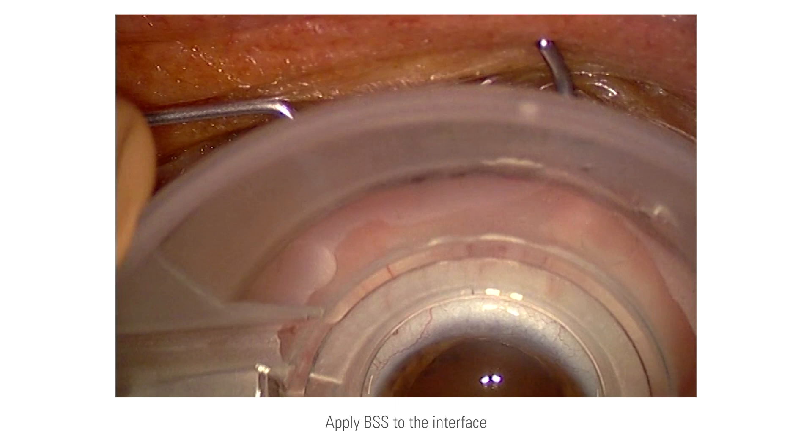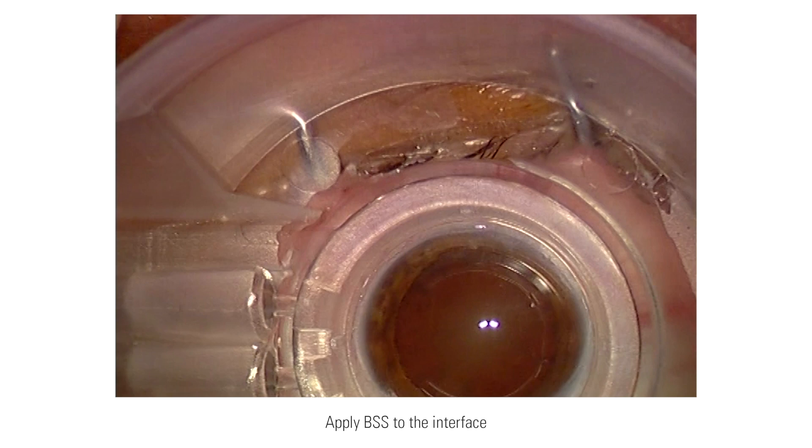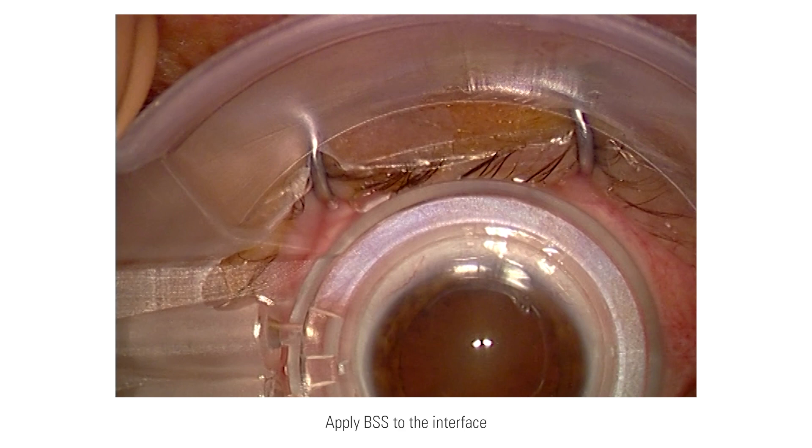The Z8 comes with a liquid interface for cataract surgery. It is a no-touch interface which maintains the shape of the cornea. The suction system contains several sensors so that the vacuum on the eye is guaranteed during the cutting process.